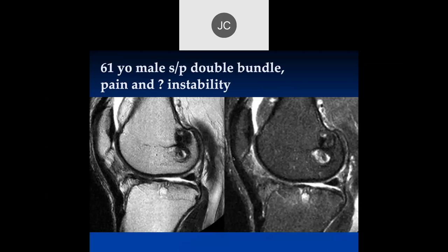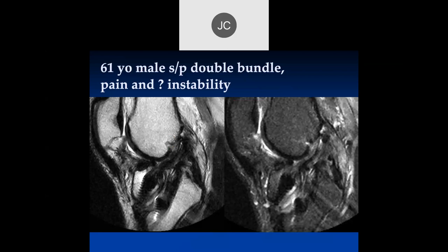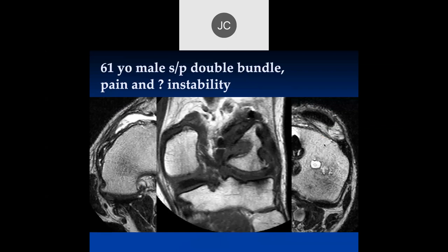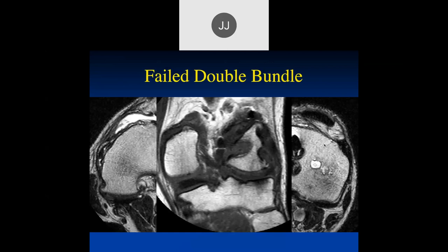So this is a 61-year-old male with a double bundle who now has pain and instability. On these sagittal views, it looks like there are two tunnels in the posterior femur. And here we can see two tibial tunnels as well, with some graft visible in both. I would never do that on a 61-year-old male - this is way too much surgery. We can see there is a little tear of the anteromedial bundle up here, and this patient became unstable. It's not well placed. So that was a failed double bundle.